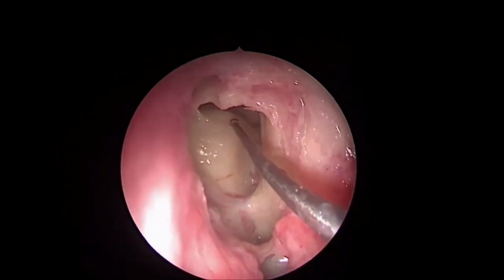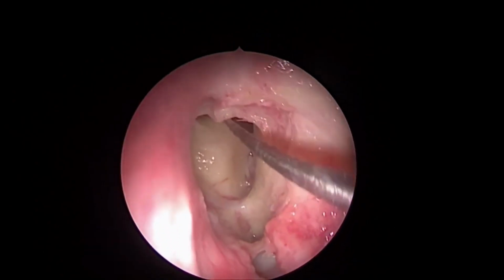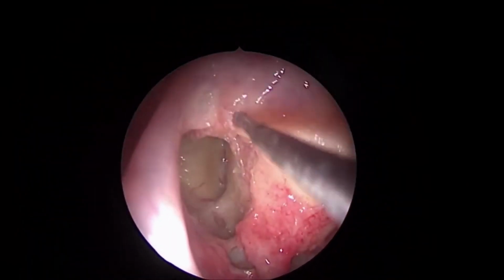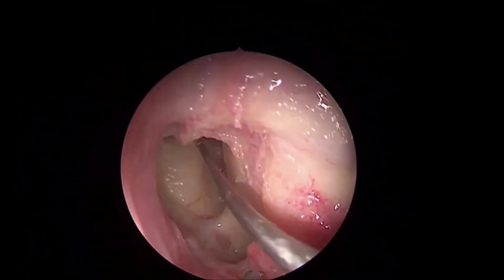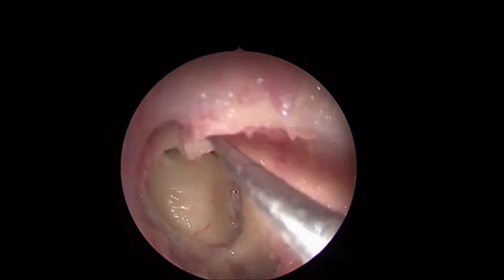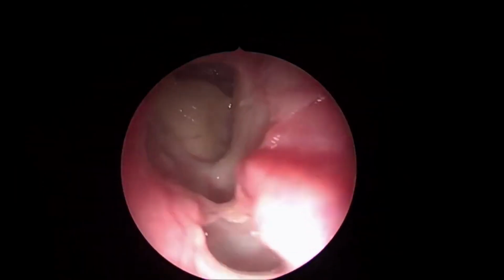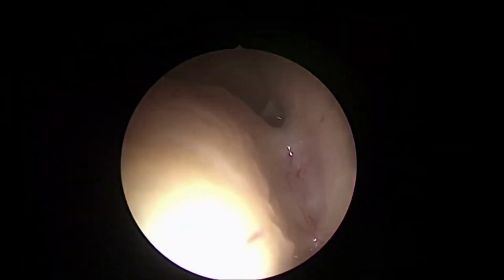So that is when you expand the anterior wall, and this anterior wall is thick bone. See, from here to here, it is almost 1.5 centimeters of thick bone. You can see this thick bone is obstructing our visualization of the interior of the frontal sinus.